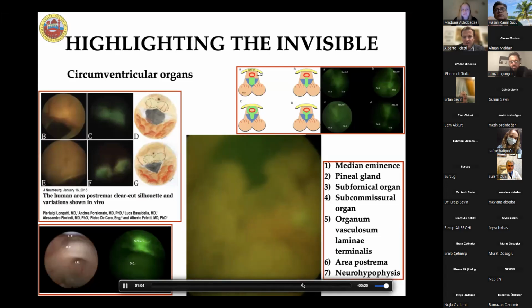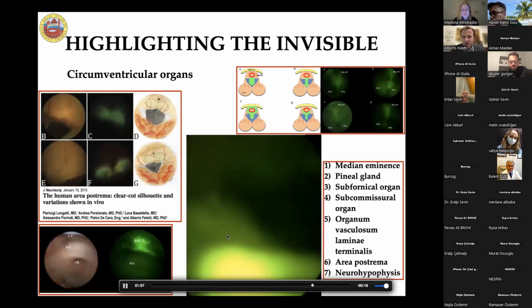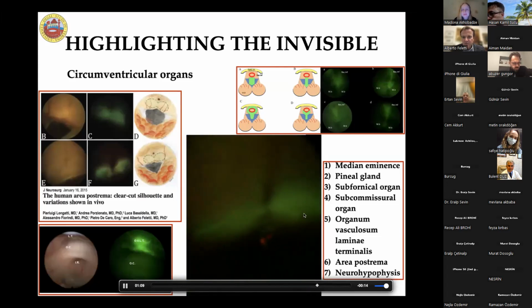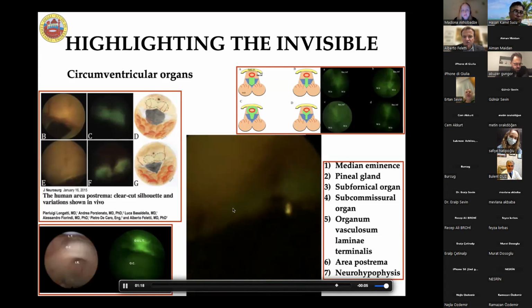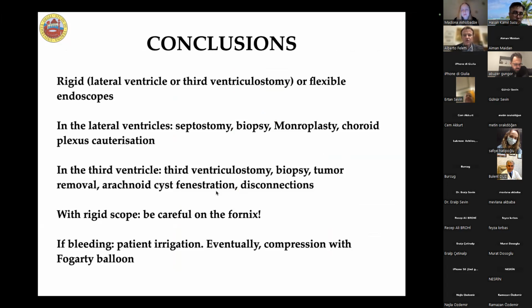this system. But if we navigate in the fourth ventricle, like we are now, and we turn on this fluorescent mode, you can see here at the level of the calamus scriptorius this area, which is the area postrema, just 2 leaves besides the apertura canalis centralis medullaris, a very important and interesting circumventricular organ.